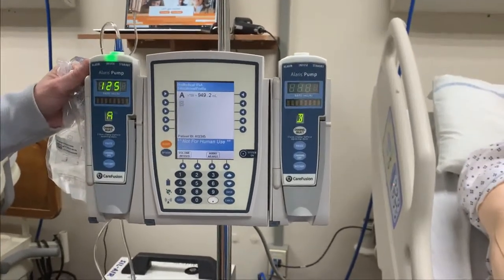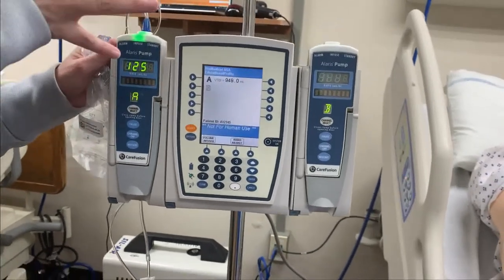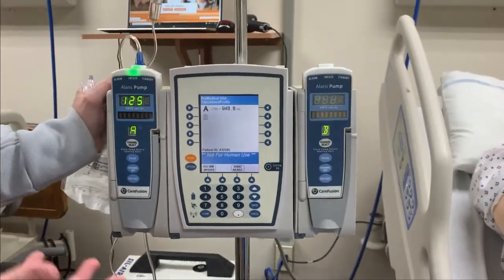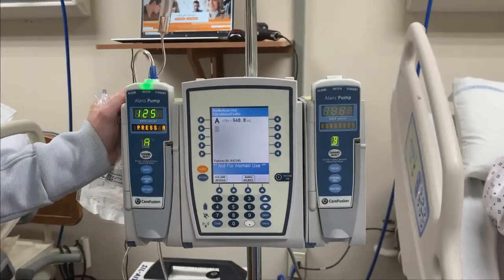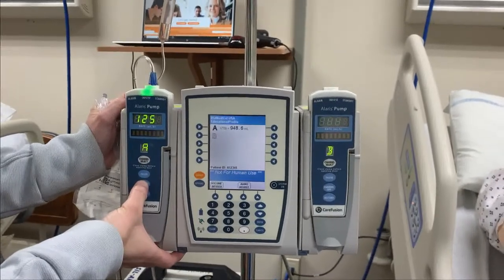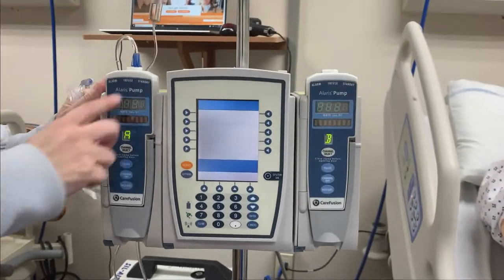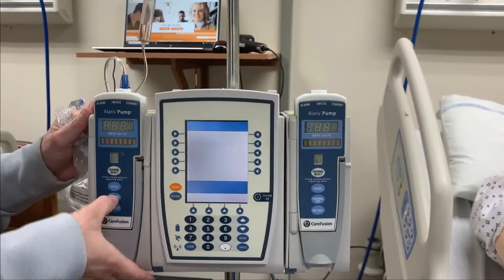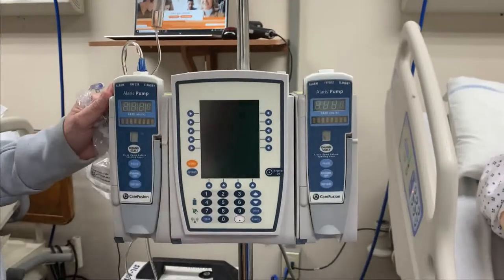There are times in your scenario when you may need to shut it down altogether — what's going in has become dangerous to your patient and you don't need it to continue infusing. The easiest and quickest way to do that is to hit channel off and let it hold for a few seconds; it's going to completely power down. In the event you had two things going into your patient and you hit channel off on one, the other will continue to pump. Because we only had one thing going, my entire pump shut down.